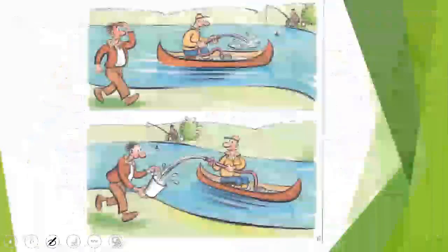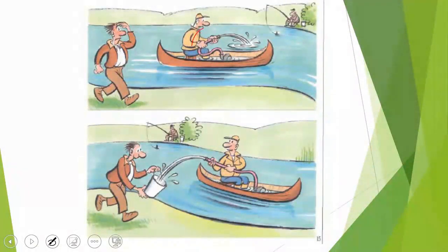It's like someone filling water from a hose into a river. The river is the main magnetic field, and the hose is the protons that have their own magnetic field. So I'm adding their magnetic field to the main magnetic field. You cannot measure the amount of magnetic field coming from the protons at that time. But if you change the direction of the magnetic field coming from the protons and make it in another direction, perpendicular to the main magnetic field, then you can measure it.